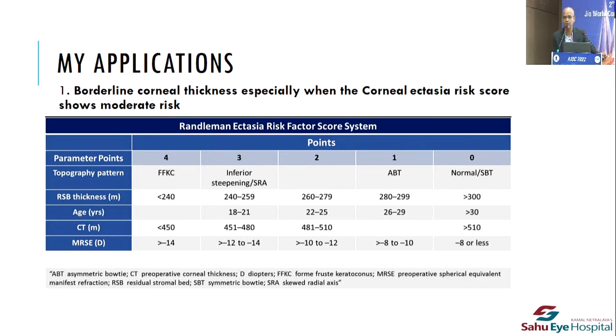Sometimes you have patients coming to you with a Corvis ST reading which shows that the biomechanical strength of the cornea is not that great. But data from Narayana Nethralaya, where they have done polarized anterior segment OCT studies and compared the corneas post-TRANSPRK, post-lamellar procedures and collagen cross-linking, found that the cornea is in fact quite stiff and strong after TRANSPRK.